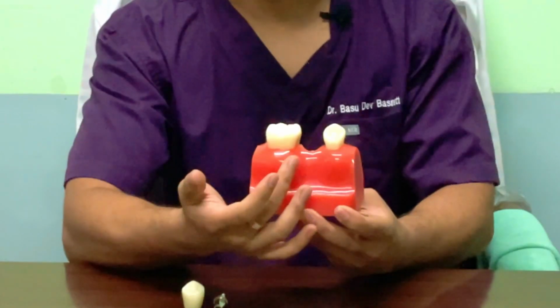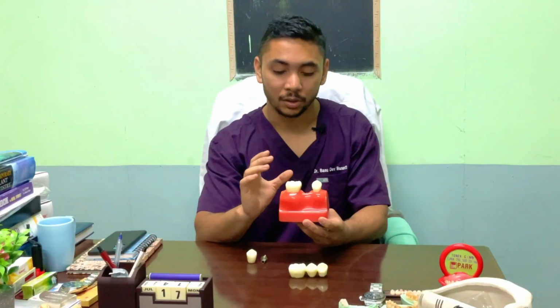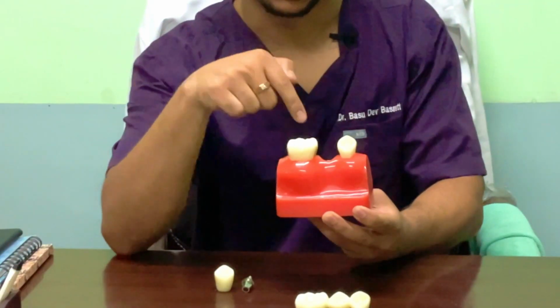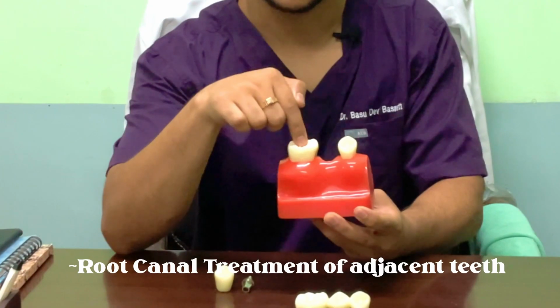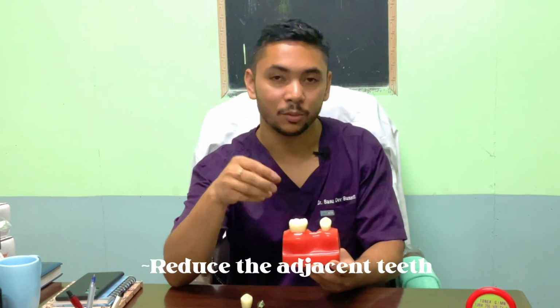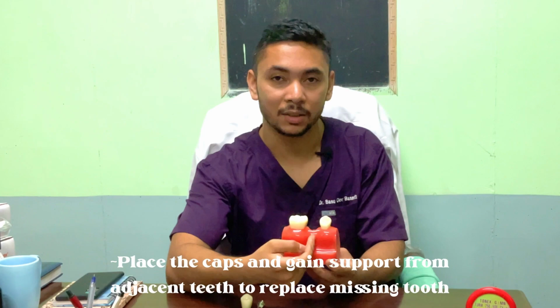As you can see, we have a missing tooth right here and there are two adjacent healthy teeth. In this process, we first do the root canal treatment of both these teeth, and then we prepare these teeth. That means we reduce these teeth to some extent so that we can place the caps and gain support from these teeth to replace the missing tooth.